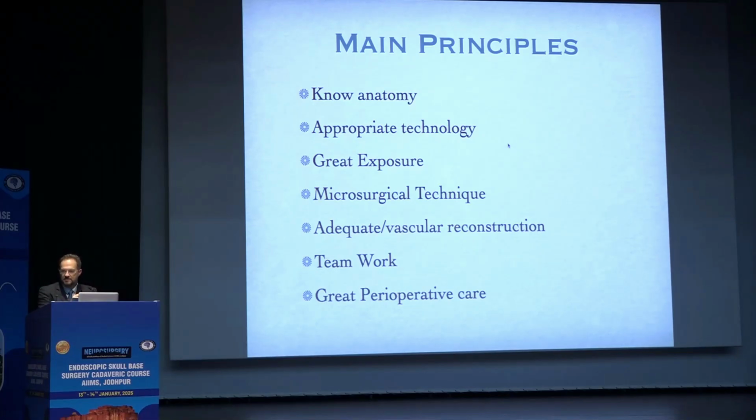can have my two hands there, using my suction in the left hand, and then the drill on the other hand, the dissection on the other hand. So microsurgical technique when you go to the intradural space is very, very important. Then reconstruction, in cases where we have a major leakage, exposure of the brain and spinal fluid, to avoid complications in general, and also to protect the carotid artery. So sometimes if you have the carotid artery exposed, it's better to cover it up.